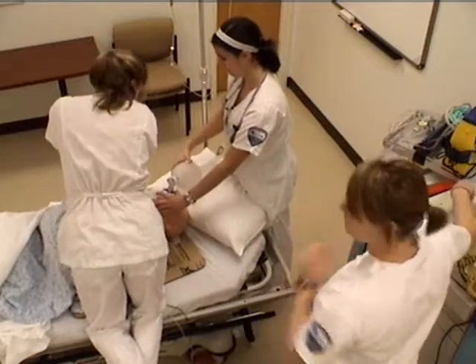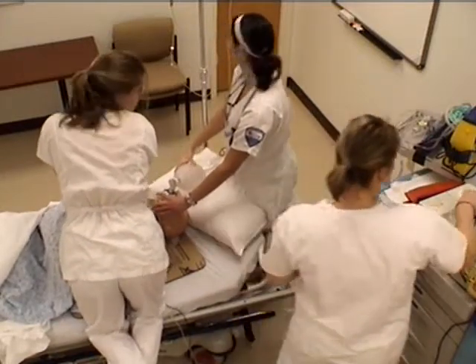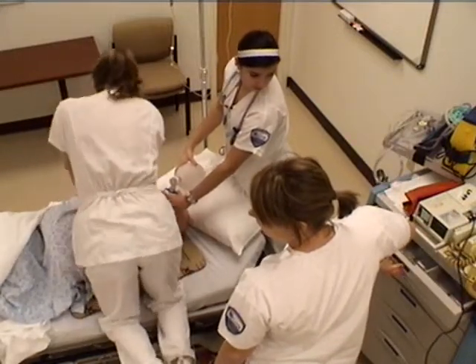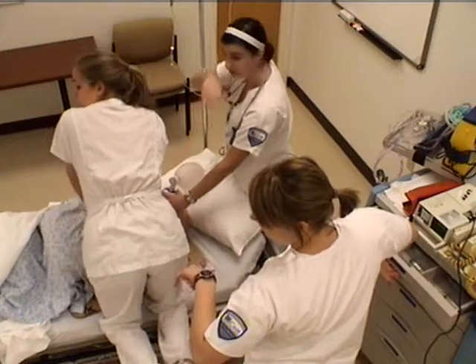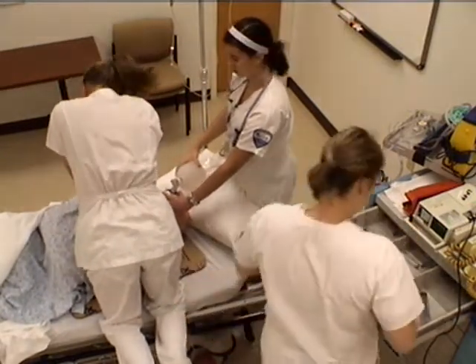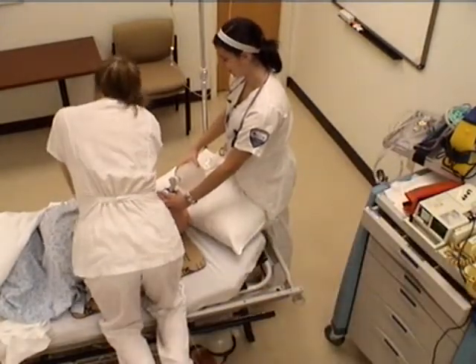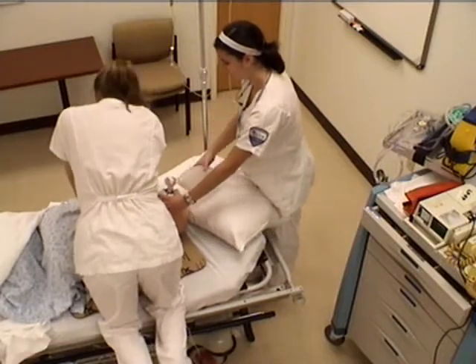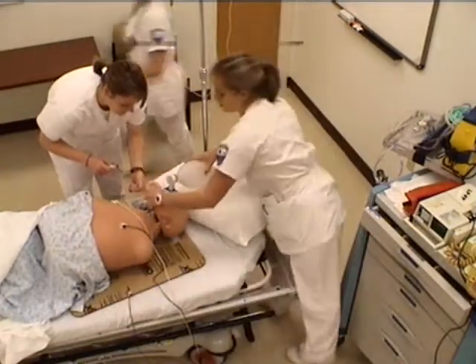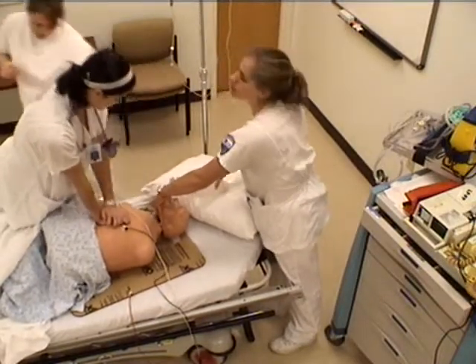What's his rhythm now? He is now in rhythm two. It's nice. You could push epi again or you could wait three to five minutes. Right. Atropine. Which is one milligram as well. After this breath. Pushing one milligram atropine. I'm going to take the second breath. Ready? Okay, it's in.